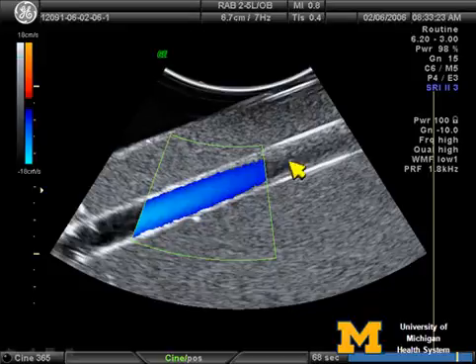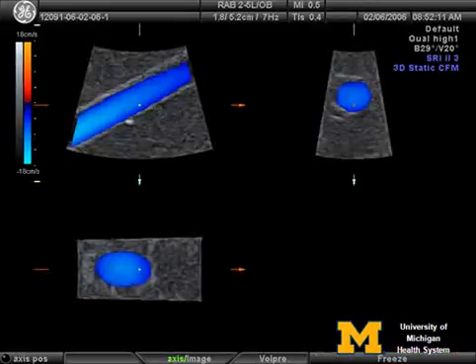Okay, this is a flow phantom. I'm sure many of you have seen this sort of thing. This is a standard 2D image produced by a 1D array, which one would see if scanning along the tube. So this is flow along the tube, and this would be very similar to what you would see if you were doing a standard color Doppler volume flow estimate.